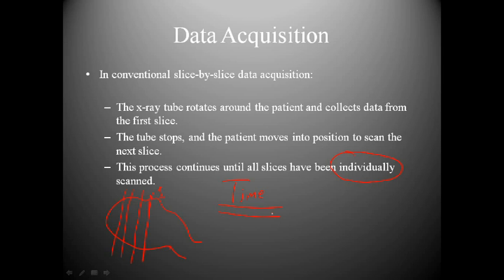I shot the ribs, took the patient back, and probably about an hour later, the ER physician decides that he would like a CT of the head. And so our facility was still utilizing conventional slice-by-slice data acquisition. We did have on our protocols a quick head, which utilized helical, but the accepted protocol at the time was to use slice-by-slice data acquisition.